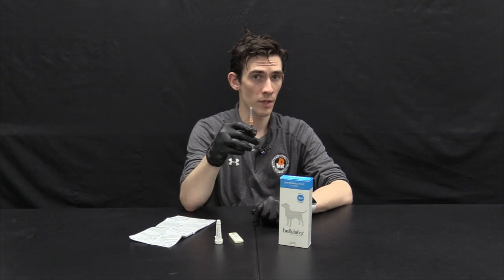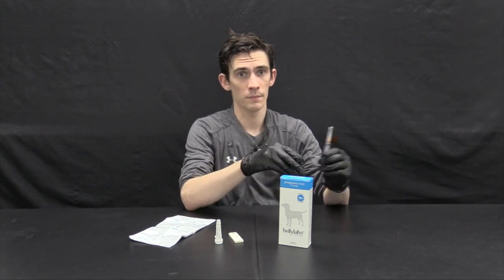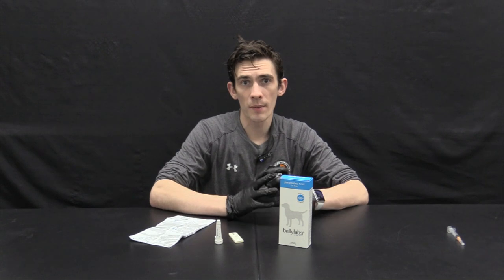Relaxin is by far the easiest. However, traditionally a relaxin hormone test is done by intravenous blood draw with a needle syringe, which isn't fun for anyone including an animal, and can also prevent some users from using it. So enter the Belly Labs relaxin pregnancy test, which works nearly exactly the same as any other relaxin test but doesn't include or need the needle syringe.